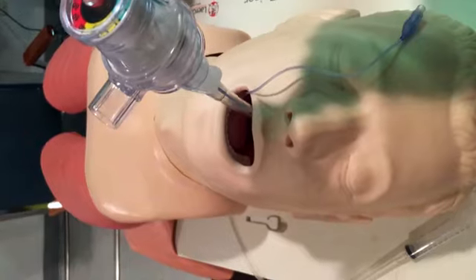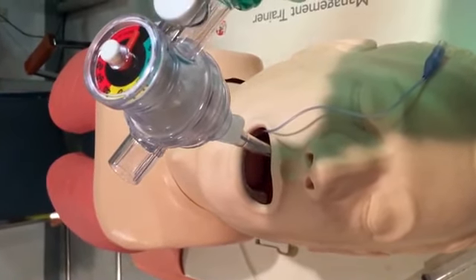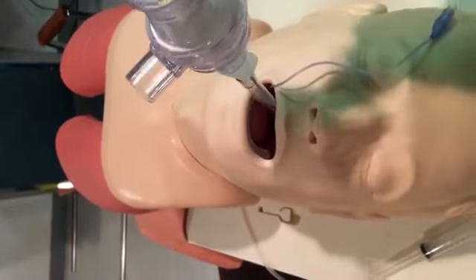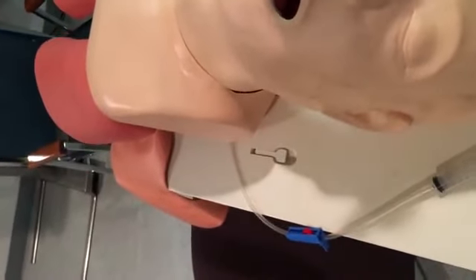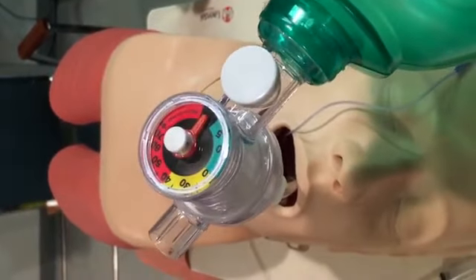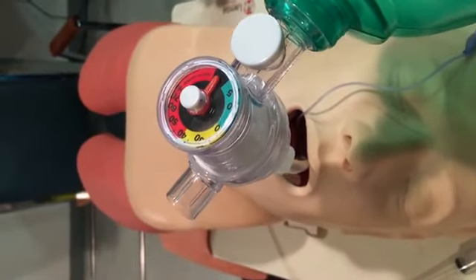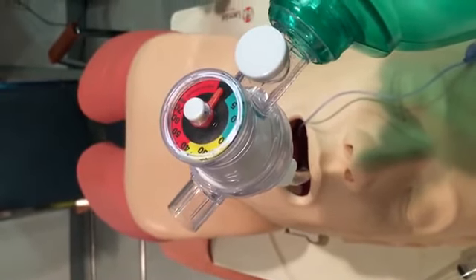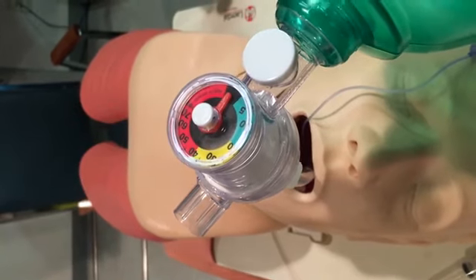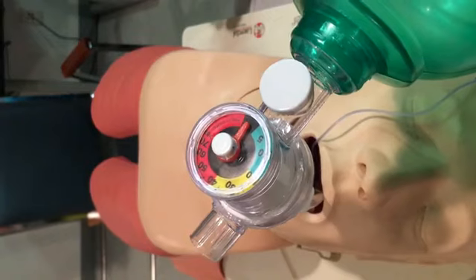Well, let's say you have a good depth, you felt really good about your intubation, and then when you check for breath sounds, you see that you actually inflated the stomach instead of the lungs, which can happen. It's an unintentional esophageal intubation. People call it when you tube the goose. So it's really important that you be able to identify the signs of an unintentional esophageal intubation.